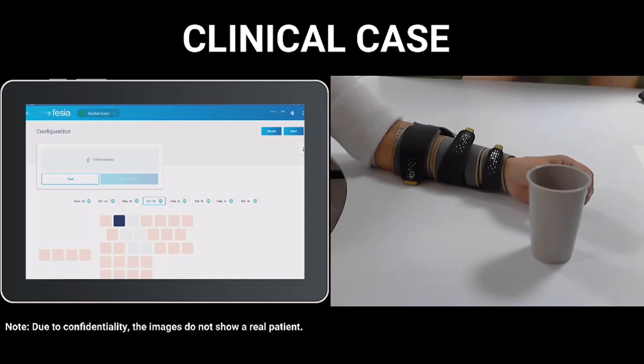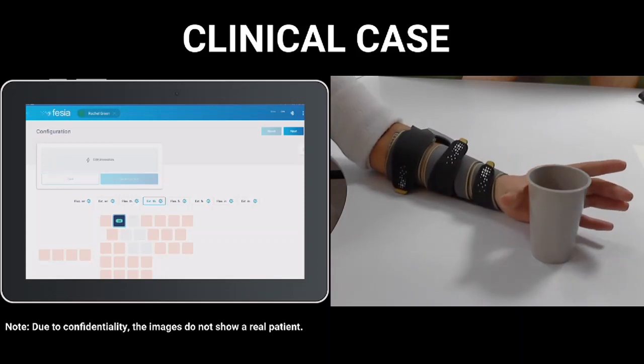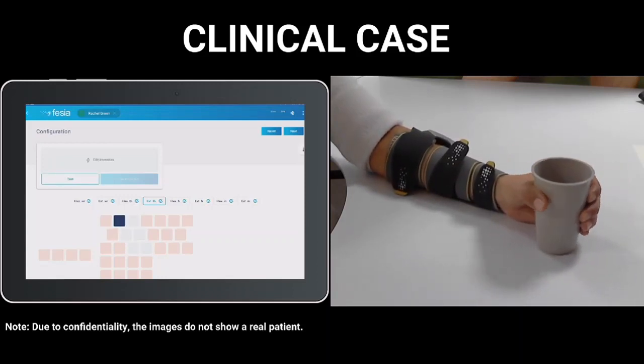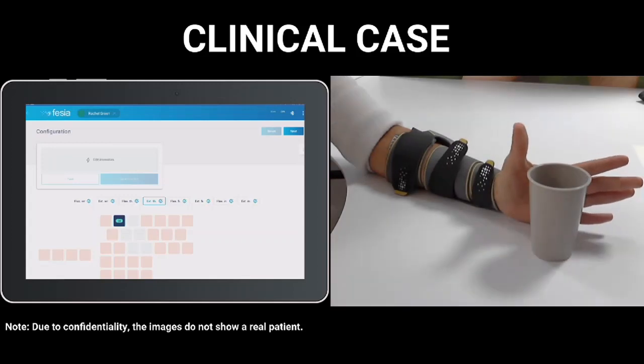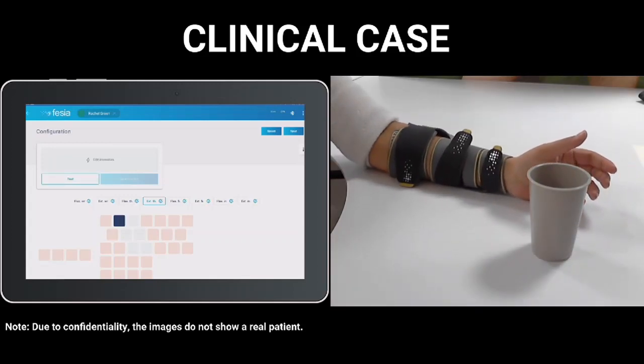Try to grasp the glass, and I'm going to press the thumb extension. Perfect. Grasp it and release it now. And I am going to press test to help her thumb. In this way, we can be very selective and train the impaired selective movements of the patient.